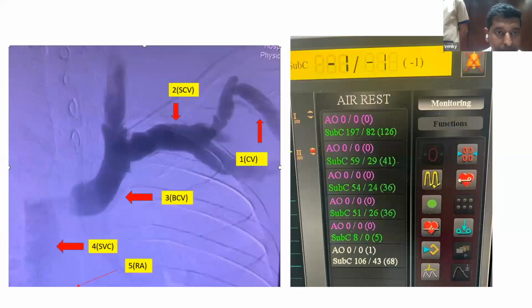So you can see the before and after images. See the ugly looking cephalic arch stenosis. It is the cephalic arch after deployment of the stent. You can see the proximal end of the stent at the junction of the cephalic arch at the subclavian vein. This middle part of the stent is intentionally kept as an hourglass. We did not do much post-stenting angioplasty to make sure it doesn't slip away into the central circulation.